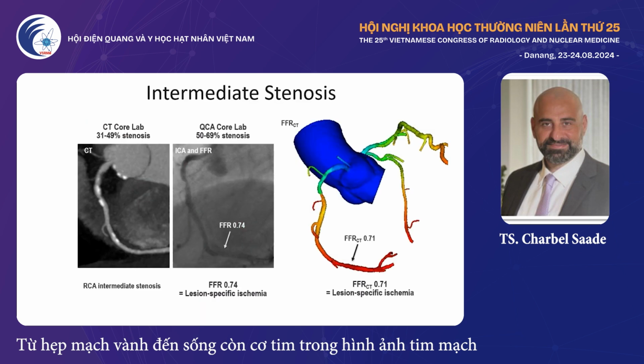When you're also looking at an intermediate stenosis, so for example, here you have in CT a nice picture with multiple calcifications. When you went to the cath lab or into interventional radiology, your FFR distally was 0.74. Definitely this patient does need to have PCI.